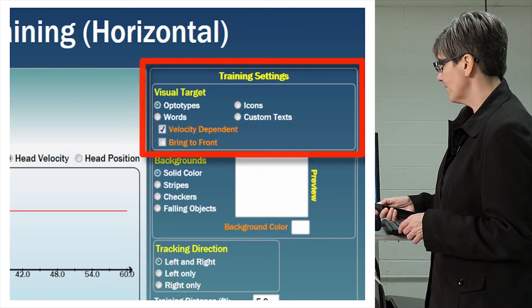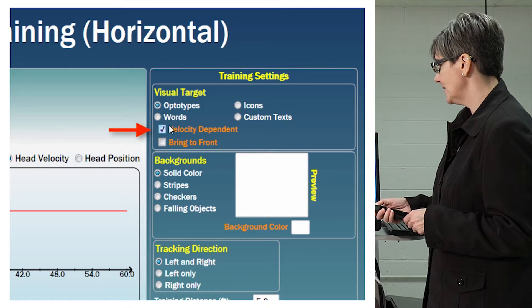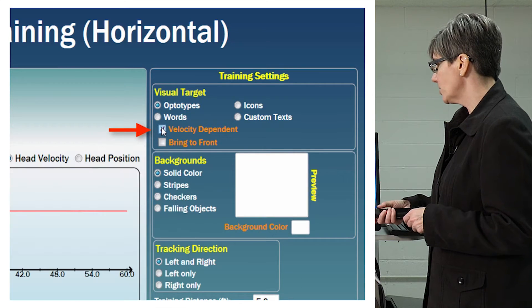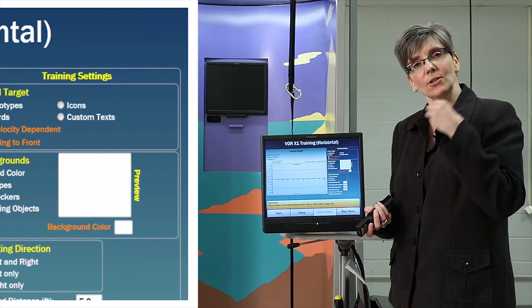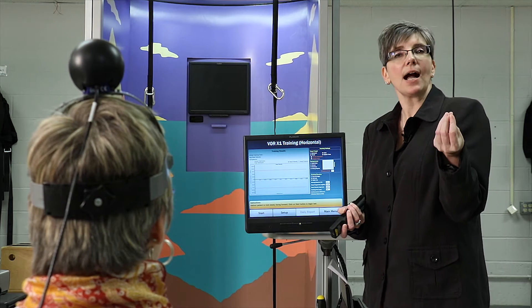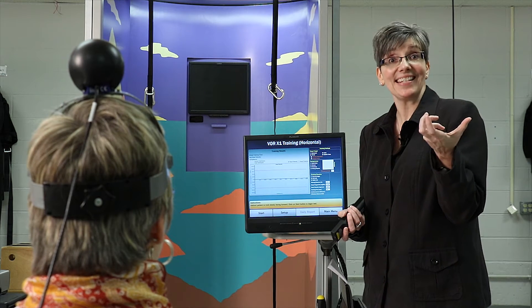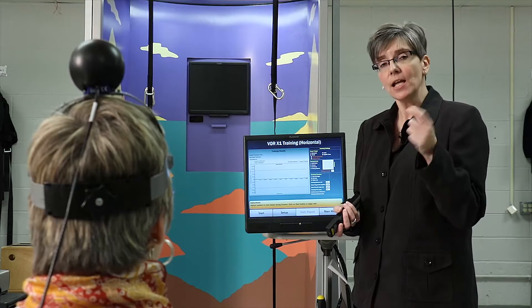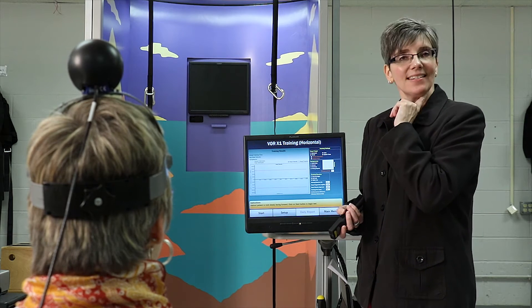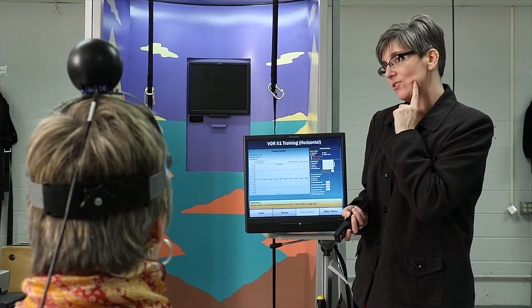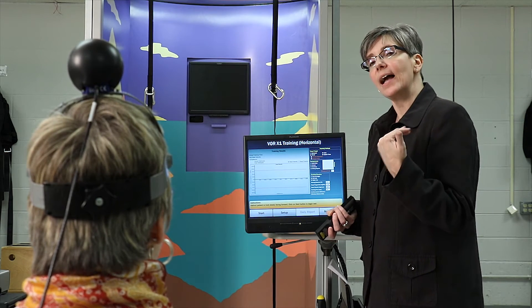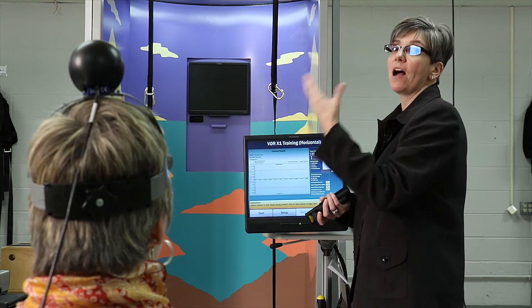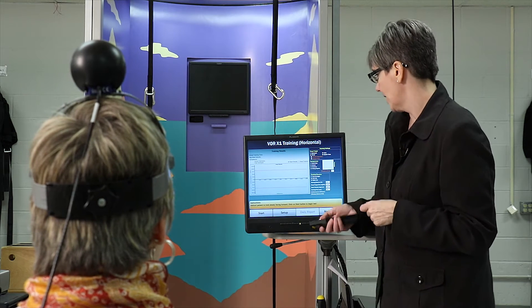You'll notice that velocity dependent is the default setting. I'm going to uncheck velocity dependent because what it does is it only shows the optotype when Mary's head is at the appropriate velocity, which means every time she decelerates to stop and change direction, the optotype disappears — so it's kind of flashing. I prefer the optotype to be on screen the entire time throughout training.